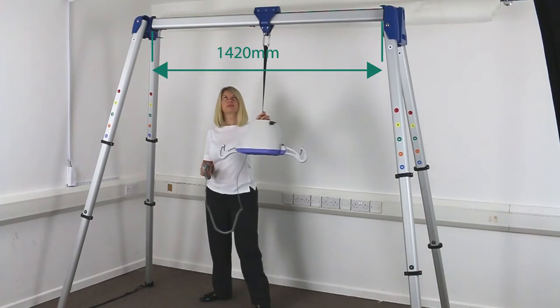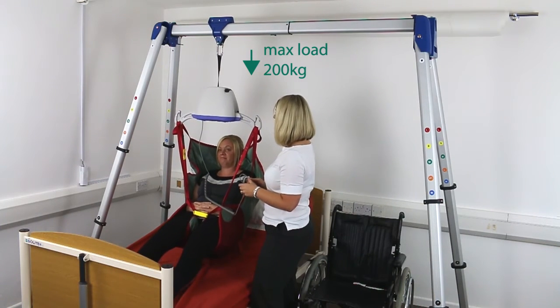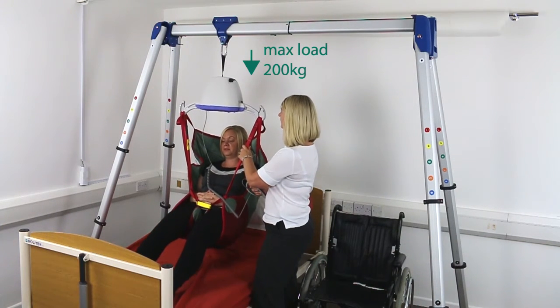The movable carriage glides smoothly along the full width and accommodates a variety of portable hoists, up to a safe working load of 200 kilograms.